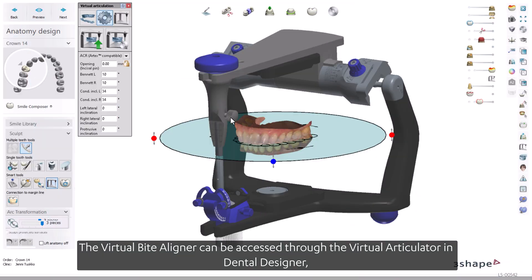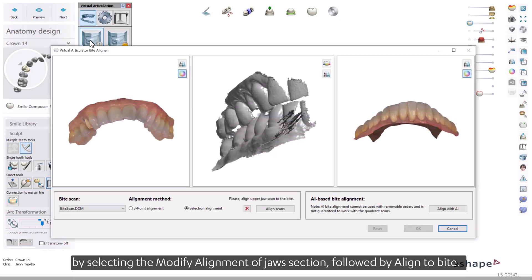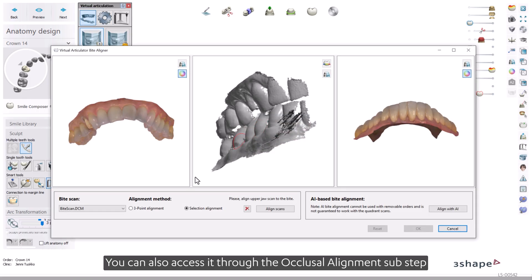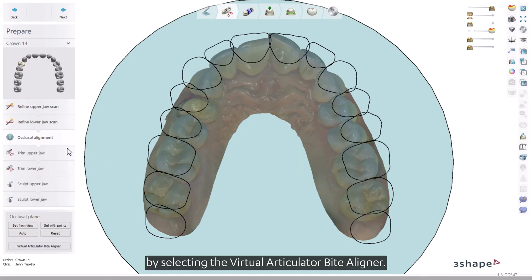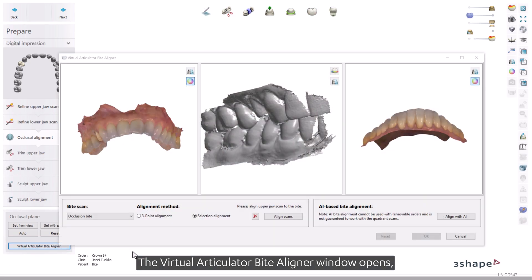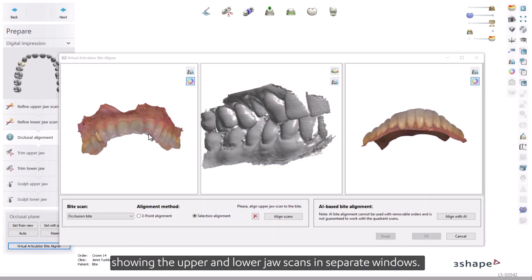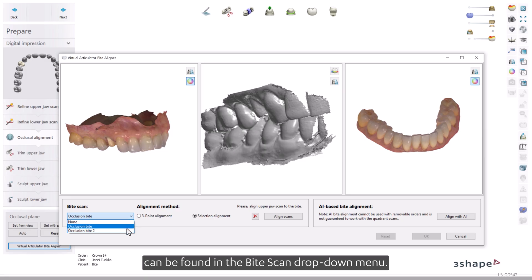The Virtual Bite Aligner can be accessed through the Virtual Articulator in Dental Designer by selecting the Modify Alignment of Jaw section, followed by Align to Bite. You can also access it through the Occlusal Alignment sub-step of the Prepare step by selecting the Virtual Articulator Bite Aligner. The Virtual Articulator Bite Aligner window opens, showing the upper and lower jaw scans in separate windows. Any bite scans that may have arrived with the case can be found in the Bite Scan drop-down menu.